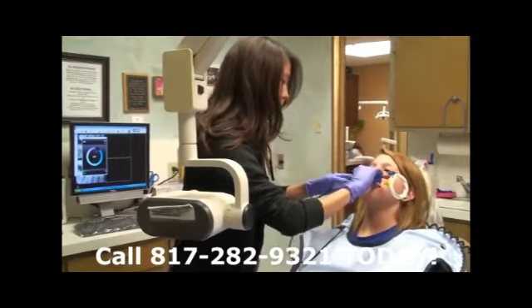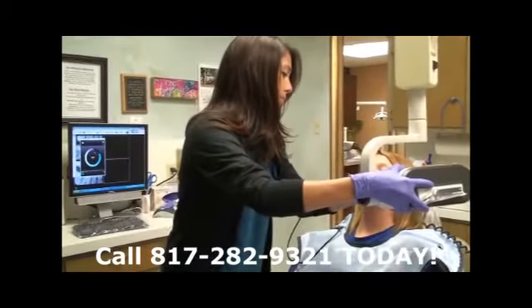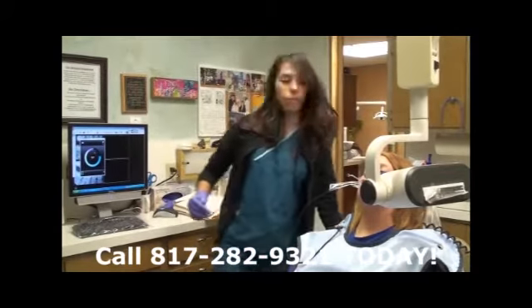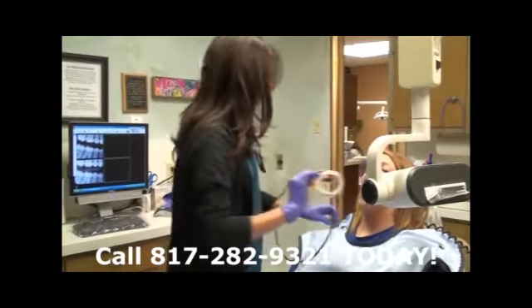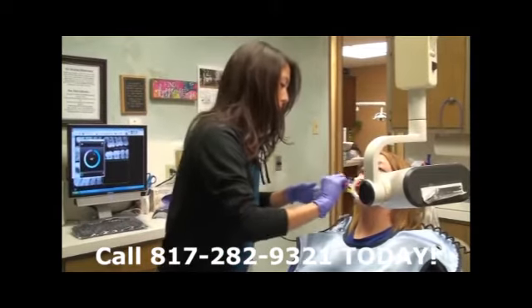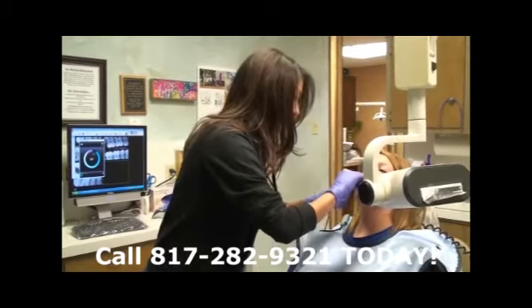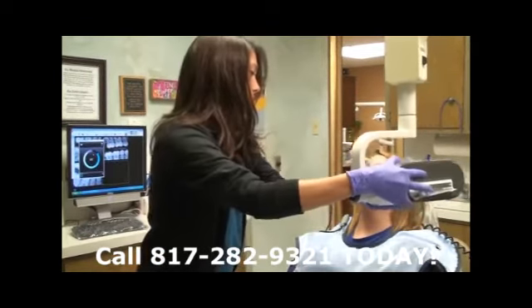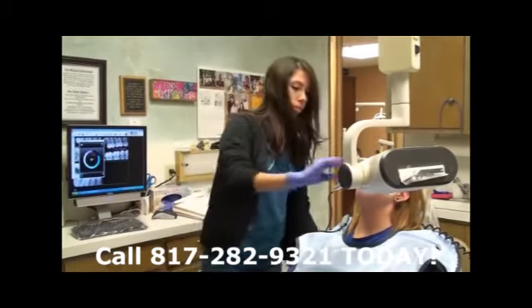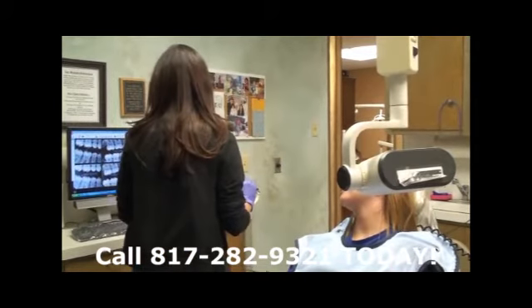And bite together. There we go. One more. Okay, go ahead and bite together. Okay. Looks good.